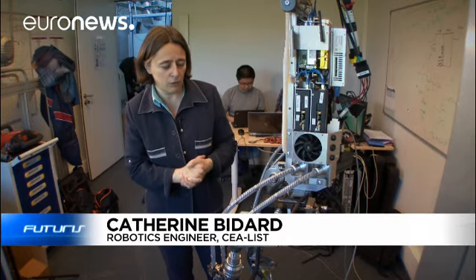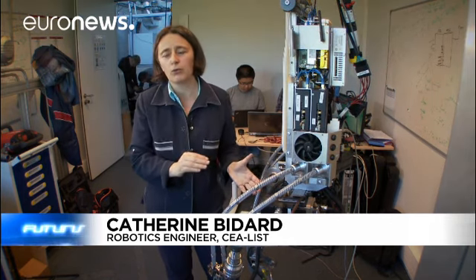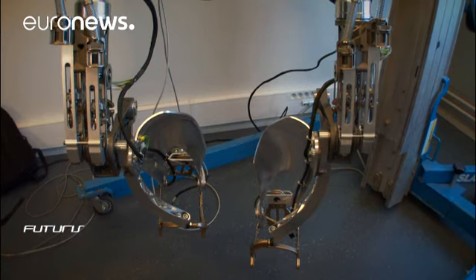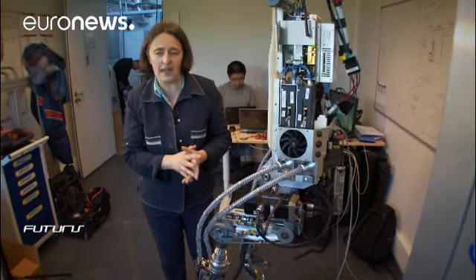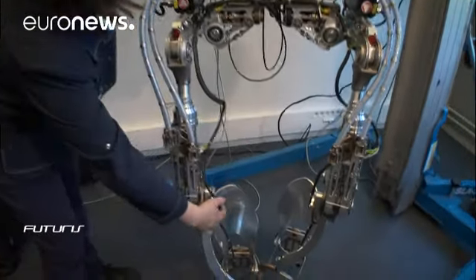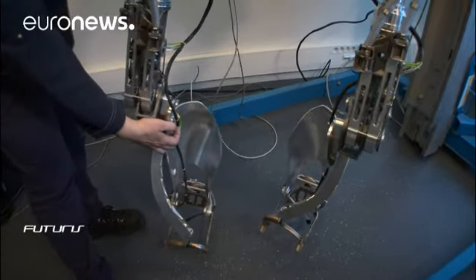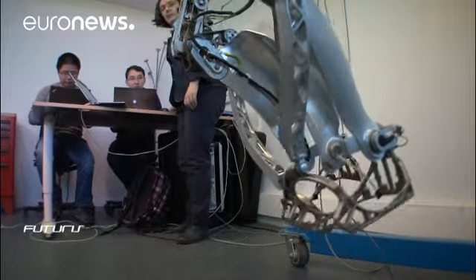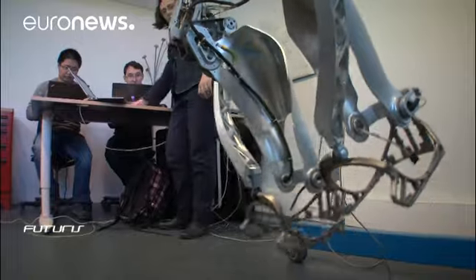This machine is developed with actuator technology that controls the effort and not just the position. What's also particular about this is having 4 motorized axes per leg. Here is a side movement of the hip that will make it possible to regain balance or to turn. Keeping balance is a big challenge.